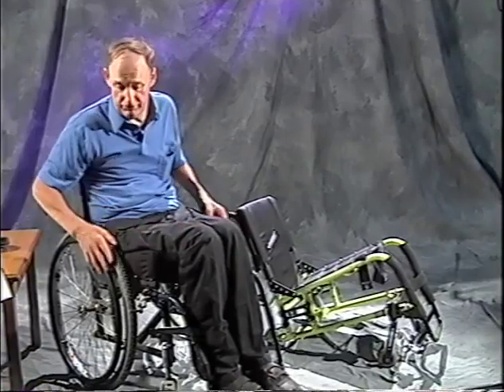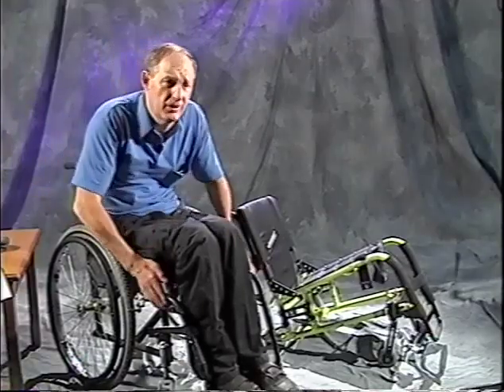And some people like more dump, some people like the chair fairly flat. The more dump you have on some chairs, the faster you can push it, because the more area of the wheel you're able to push. So it's sort of like changing gears on a car. If you lower yourself into the chair, the more wheel you can push, and the further you can push with each stroke. But if you get too low, then the wheels become up under your armpits, then you're not able to wheel at all correctly. So there's a fine area there where it will feel comfortable, and then where it's not comfortable.